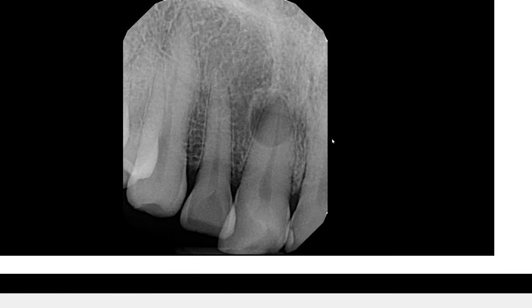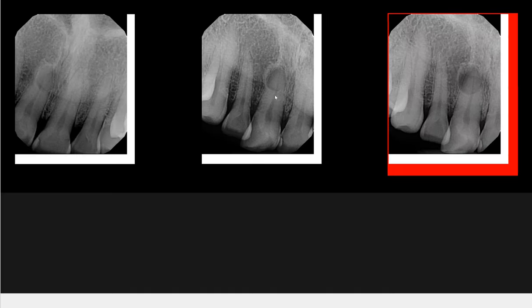Now fast forward two years, and you can once again visualize that radiolucency. Has it changed much? Not very much — but did it grow a little bit? Look carefully between the two. Yes, it did, ever so slightly. It has definitely grown. Whatever this is, it has changed very little over the last two-year period.